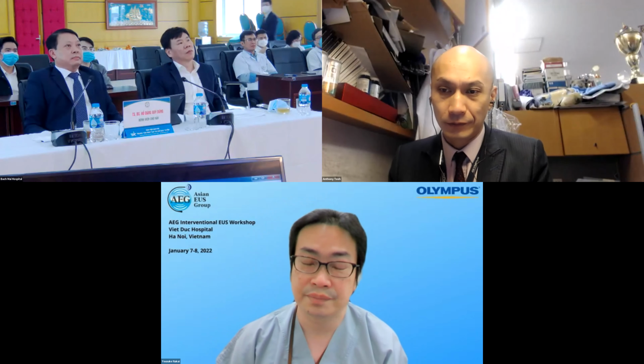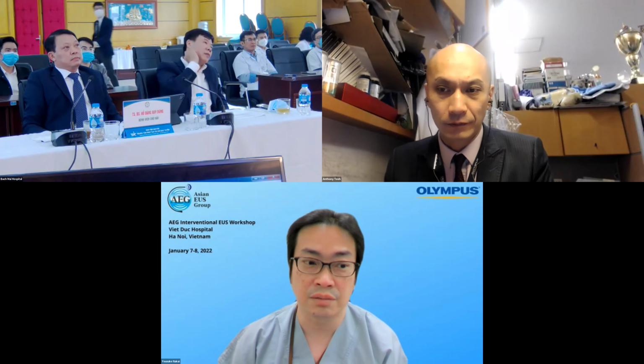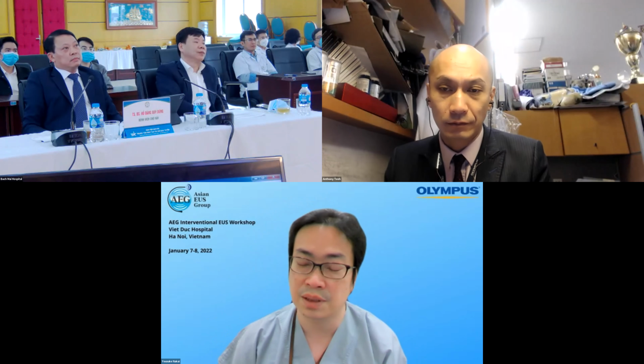There's a question for you, Nakai. Do you perform FNAB for gallbladder cancer? Yeah, sometimes. For gallbladder cancer, we cannot pass through the lumen of the gallbladder, but if it's embedded into the liver, then we can perform EUS FNA of the gallbladder cancer, or we can target lymph nodes around the gallbladder to get a diagnosis of cancer.